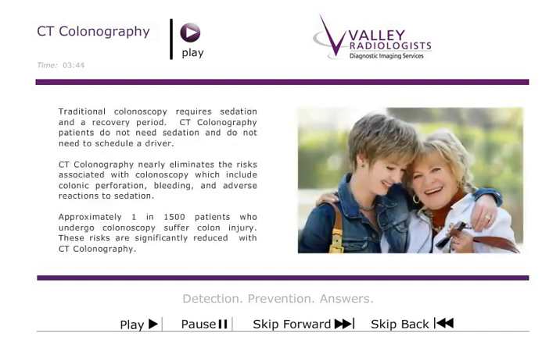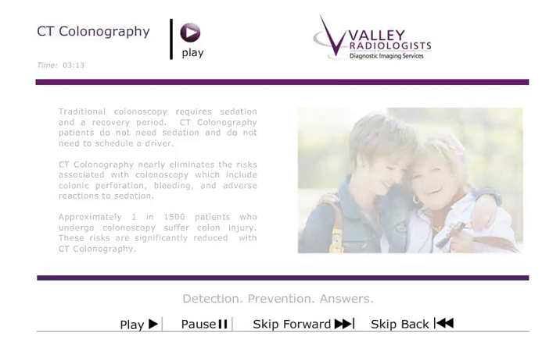Traditional colonoscopy requires sedation and a recovery period. CT colonography patients do not need sedation and do not need to schedule a driver. CT colonography nearly eliminates the risks associated with colonoscopy, which include colonic perforation, bleeding, and adverse reactions to sedation. Approximately 1 in 1,500 patients who undergo colonoscopy suffer colon injury. These risks are significantly reduced with CT colonography.